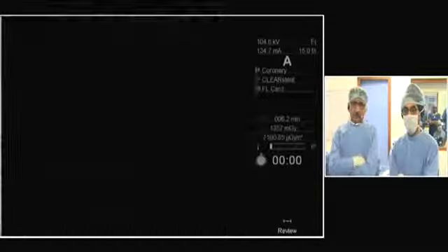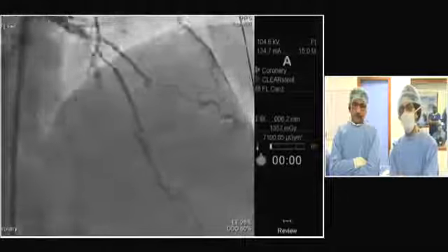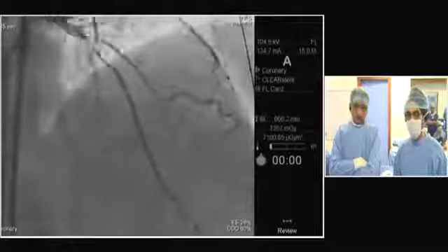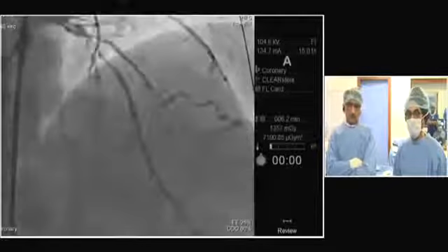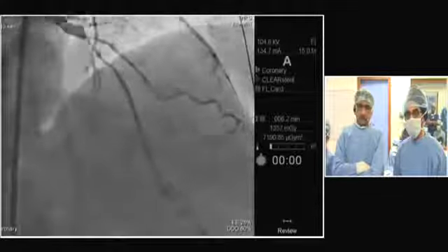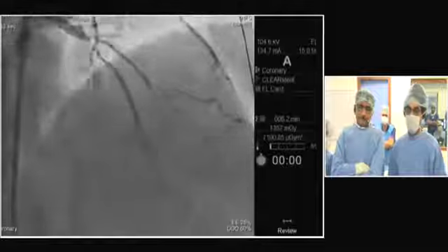So this is the picture from today's angiogram, and we see a complex bifurcation which we are going to handle, and then we have an obtuse marginal to handle. RCA we're going to leave because of the old infarction. So this has a tight lesion in the diagonal and a big LAD which has a long lesion starting just after the diagonal. We see a big aneurysmal sac just proximal to these lesions, and this diagonal is reasonably big sized with a tight ostial lesion which is extending a little bit forward.